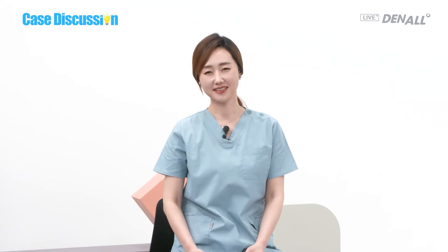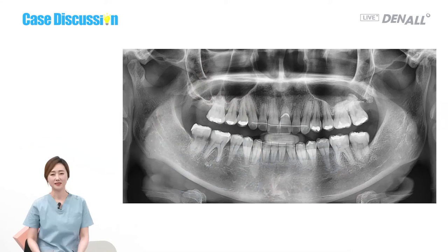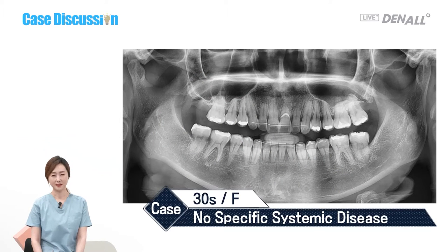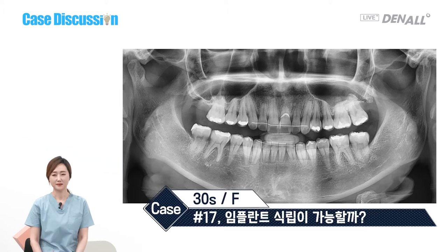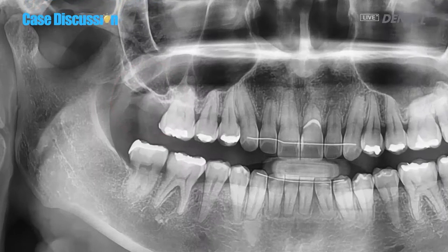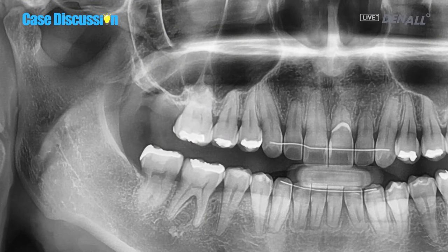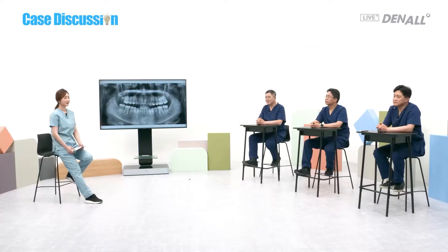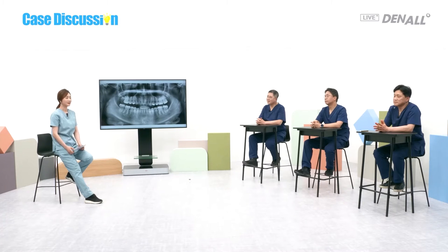This is the first case discussion. Let's have a look at the first case: a 30-year-old female patient, no specific systemic disease. At number 17, the patient wants implant placement and prosthesis. On the panorama, the upper right second molar is missing — no trace of extraction socket, so it seems it was extracted long ago. In the sinus, pneumatization is severe. The residual bone looks 1 or 2 mm, and there is a septum in the sinus, so sinus lift would be difficult. There is no CT image, which is regrettable. Based on this image, what do you think?